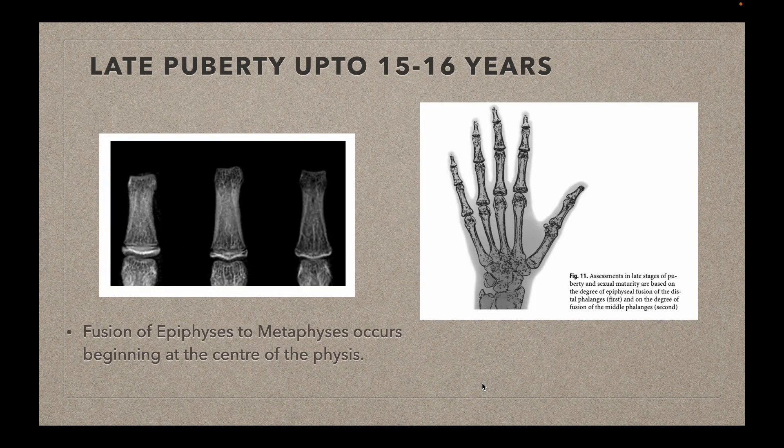The next stage is the late pubertal stage, up to 15 to 16 years. By this time, fusion of the epiphysis occurs, and the pattern of fusion starts in the center and progresses laterally on both sides.